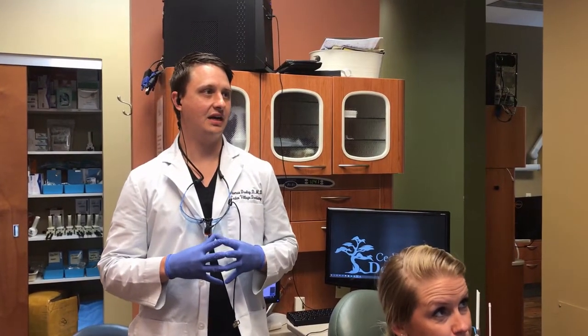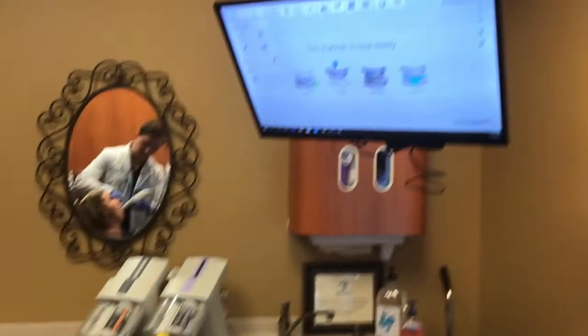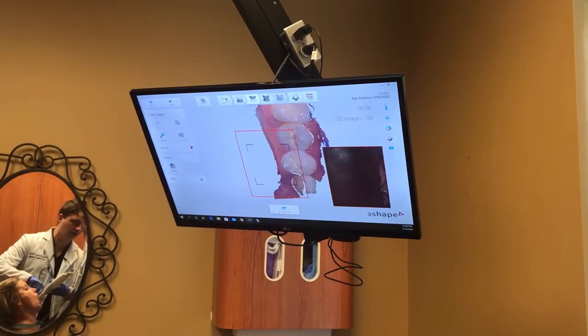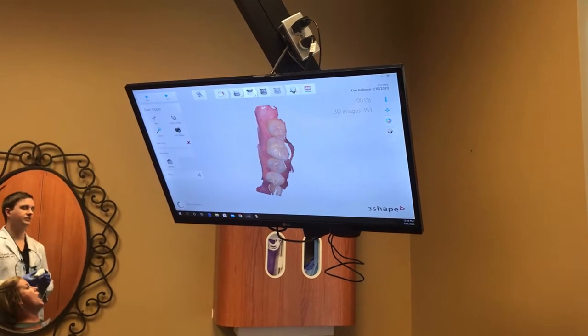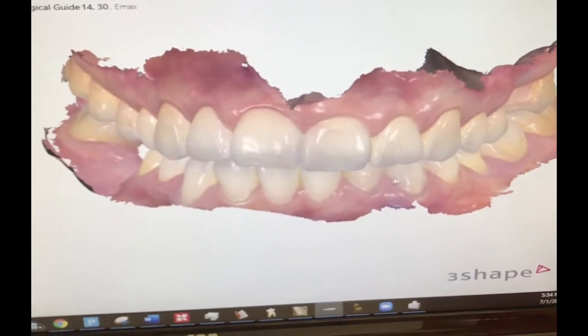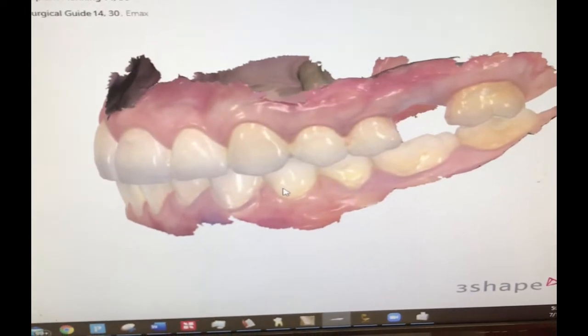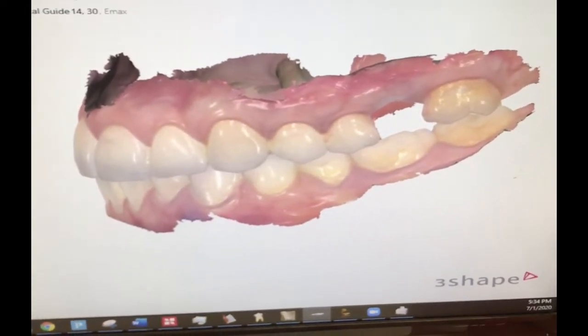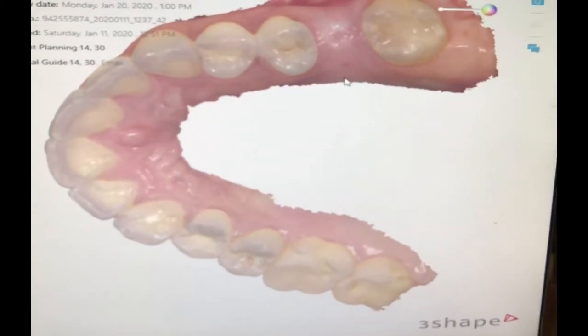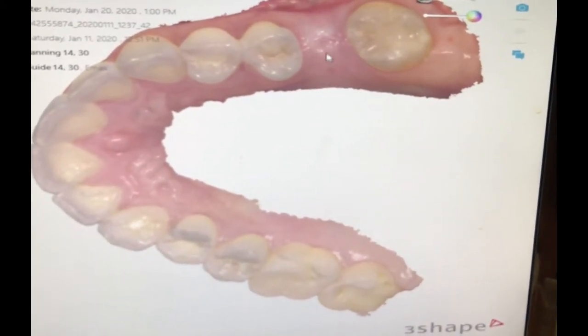The first step is taking an intraoral scan, which eliminates any impression material. We take this wand and start scanning — everything appears in color. This is our final result with the intraoral scanner: you can see it in actual color, showing where the space is. We are planning the implant in this space, and we can flip the lower arch to the side and show everything right there to start planning it all out.